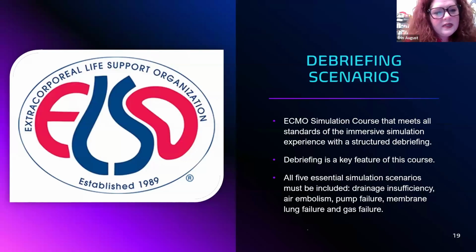In the end, after doing all of these things that we discussed, debriefing scenarios are always a wonderful, great tool going forward, saying, yes, this works, this doesn't work. It creates, again, a platform and a place where you can safely ask questions. And you should even do these after you have situations. So this debriefing applies across the board. So you start using it as best practices in wet labs, in simulations. And then when you take what you've learned and you've practiced over and over again in those wet labs and situations, then you apply it in the debriefings after the actual scenario.